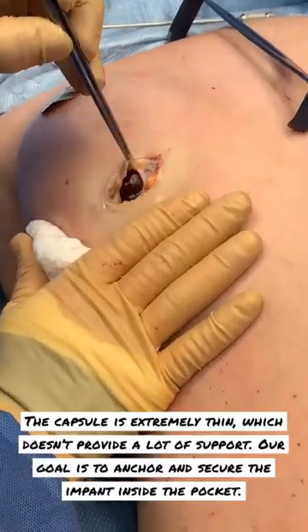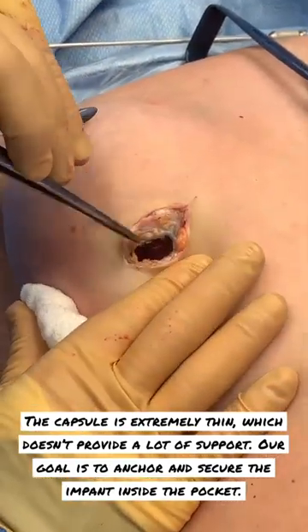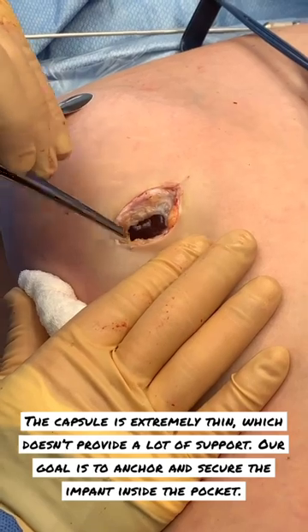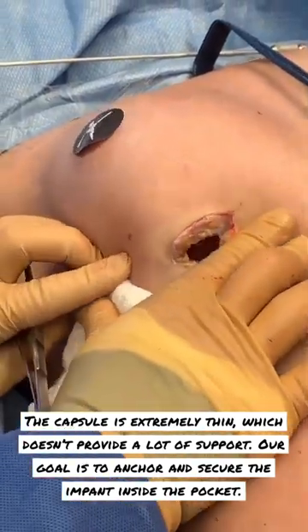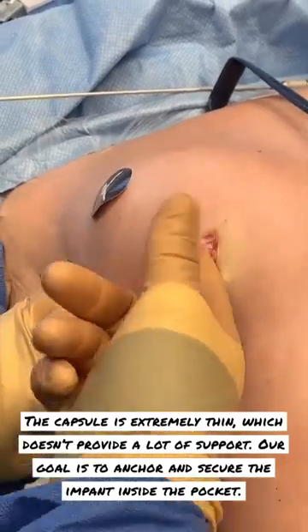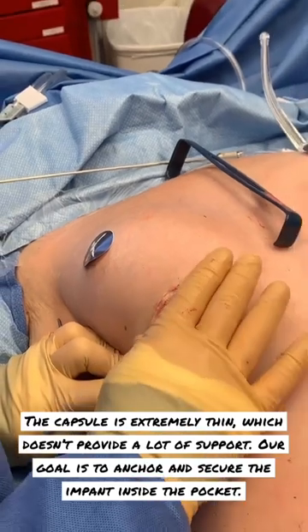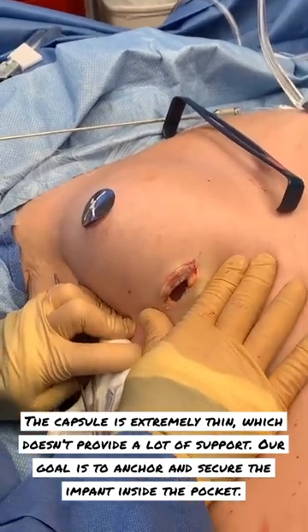We can look at our capsule — it's paper thin here. I can see right through it. If I pull it up, it's super, super thin. So we expected that kind of weaker capsule. Clinically, you can see that's what's going on. Our goal here is to anchor it up, get it secured down. Now there's not a lot of pressure because we have that pocket expanded, so the secure anchoring should do a great job of fixing the problem.